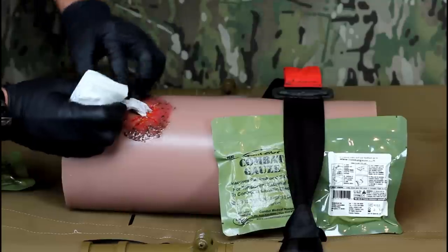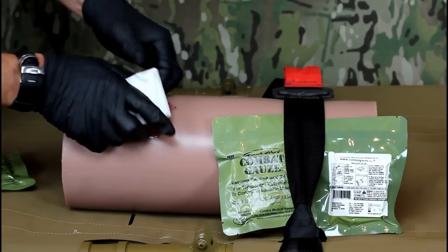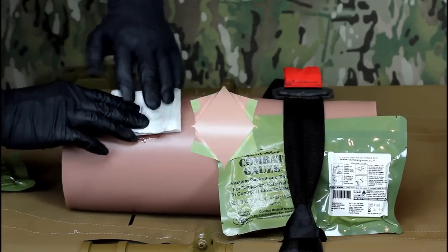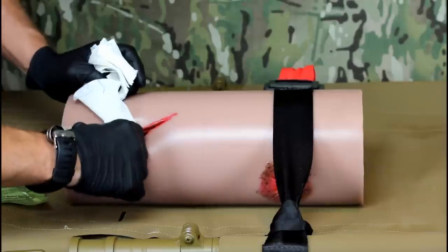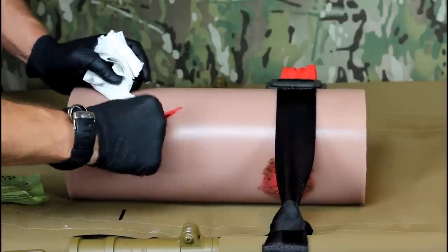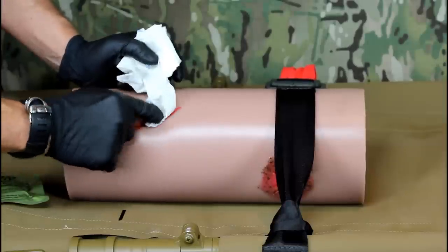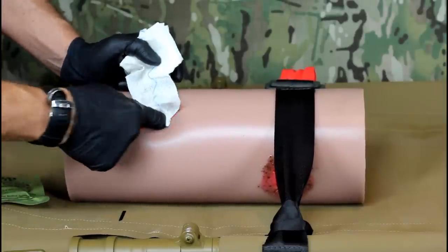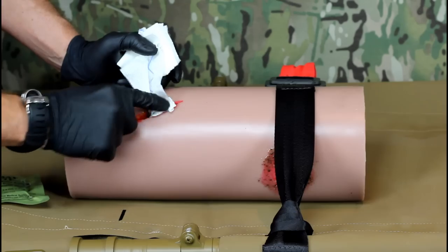Pack the wound completely and fully, including filling any gaps or channels away from the main wound. A wound may not always present as a round hole. Regardless of the wound size or shape, you must fill it completely with combat gauze. Start at the source of bleeding and work outward, packing the space tightly with the gauze as you go.